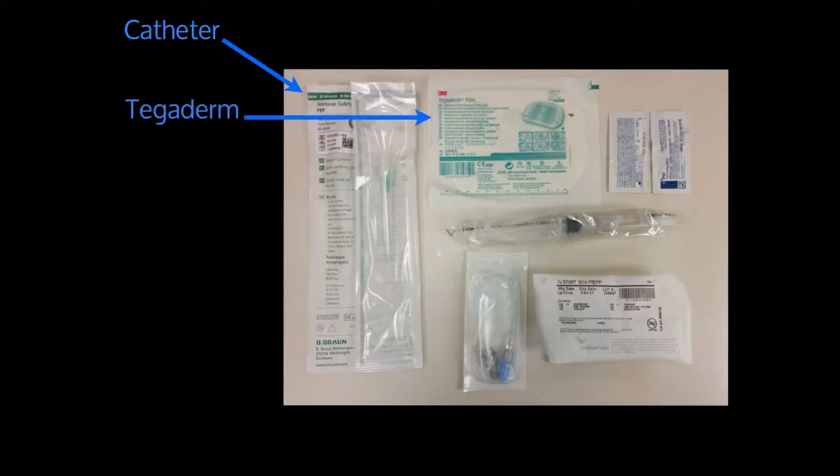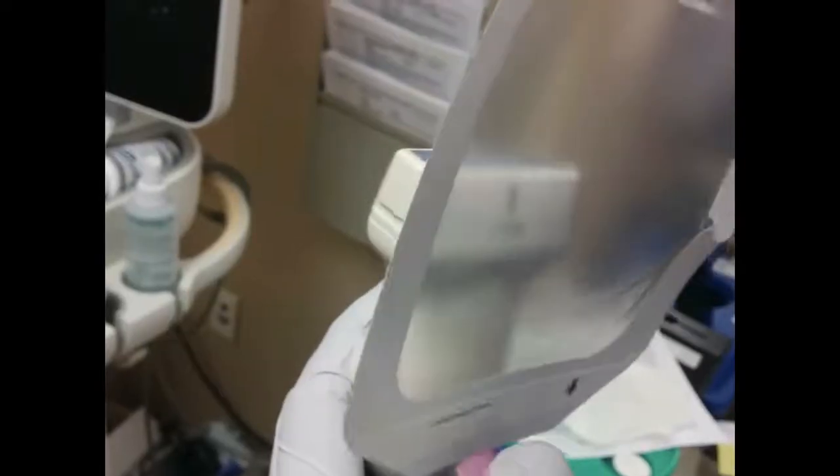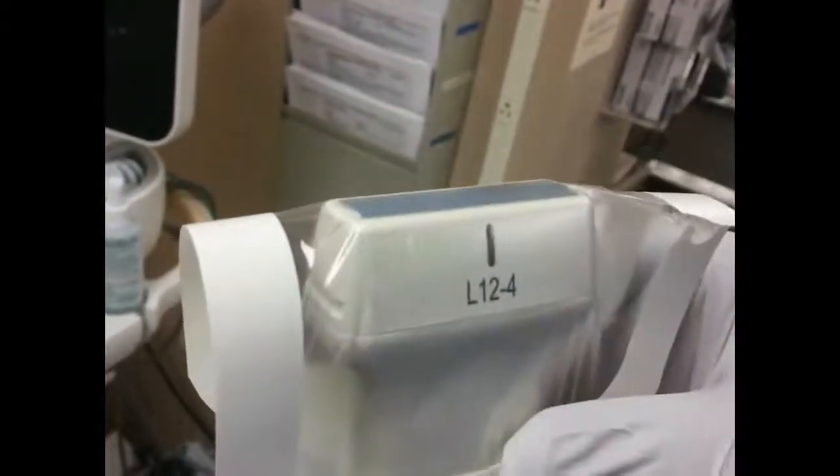Next, you're going to want to get a sterile tegaderm to put over the probe cover — it just keeps things a little bit cleaner. This is a semi-sterile technique, but I like to be as sterile as possible. Get the gel — I don't like using the ultrasound jelly bottle from the machines; I use these ultrasound jelly packets, which I think is a little bit cleaner. Then get your flush and your regular IV start kit. When putting the tegaderm on the probe, you don't need any jelly between the tegaderm and the probe — just make sure there are no bubbles or bumps.